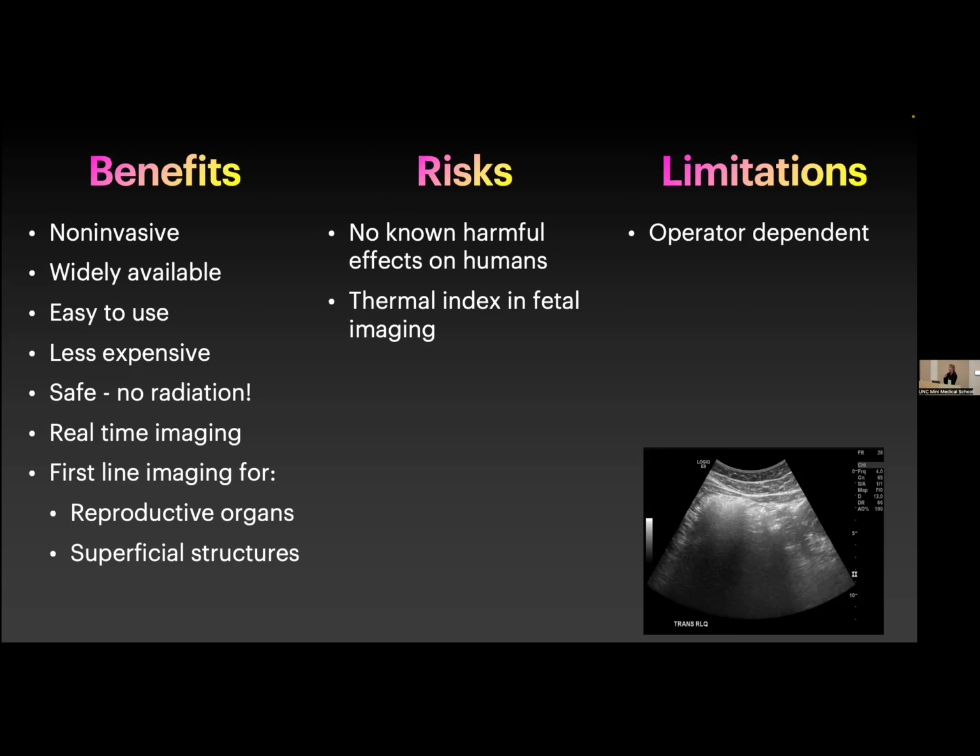Limitations: operator dependent, right? If we can't get the right pictures, we can't make things appear. If things are in the way, we can't see it, we're going to be stuck. So operator dependence, not getting the right images we need, or things in the way, bone, gas, or a lot of soft tissue, that might be trickier for us to get the pictures we need to make the diagnosis.